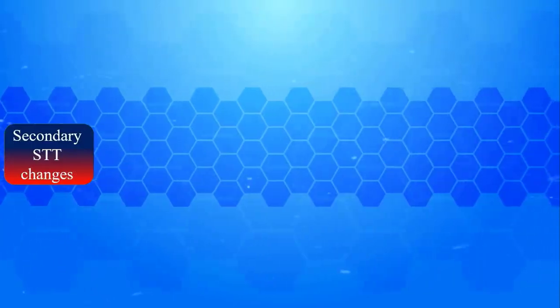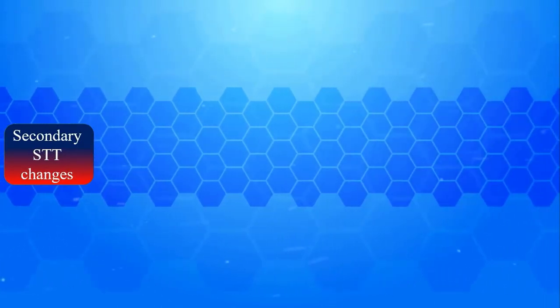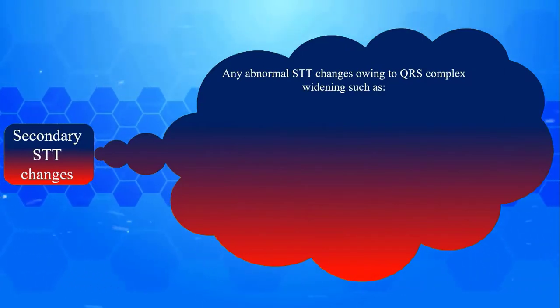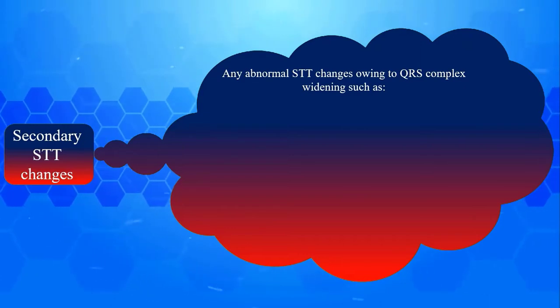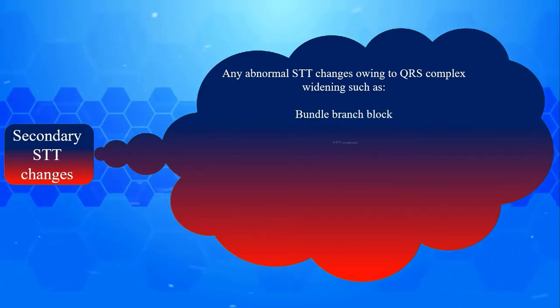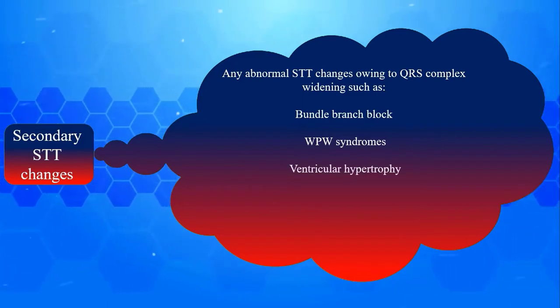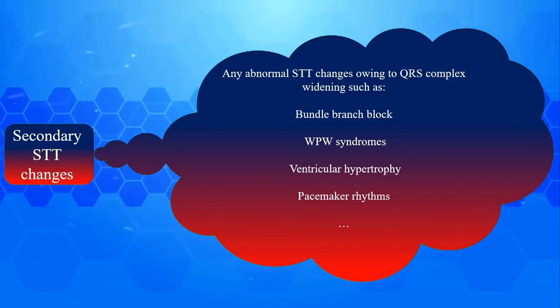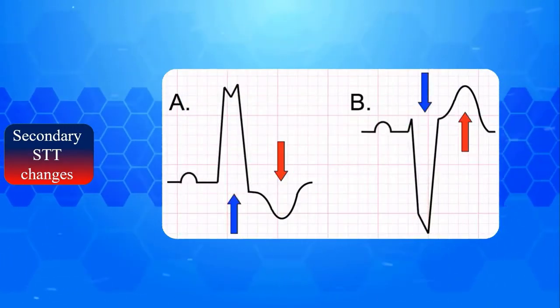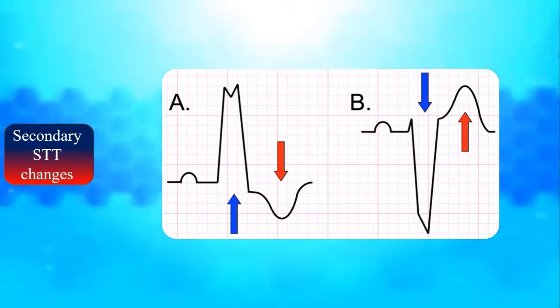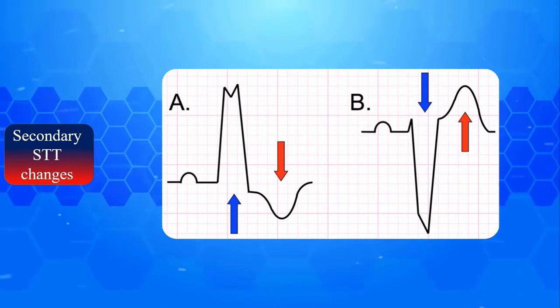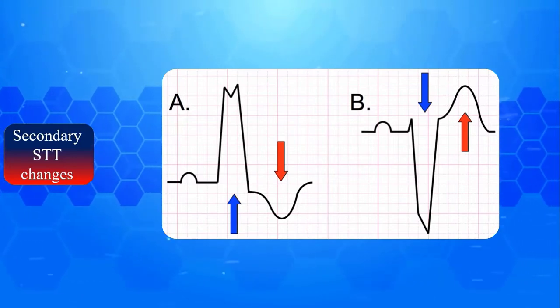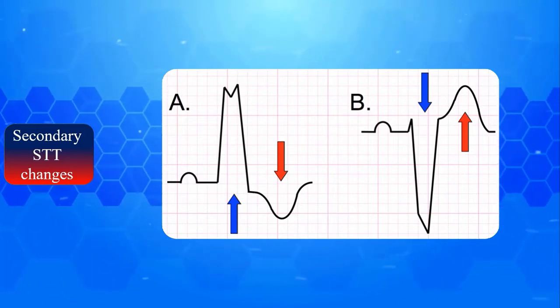In addition to cardinal findings, secondary STT wave changes are frequently observed in LBBB. Secondary STT wave changes is an umbrella term referring to any abnormal STT wave changes due to QRS complex widening. It is associated with bundle branch block, WPW syndrome, ventricular hypertrophy, pacemaker rhythms, and so on. In general, secondary STT changes are discordant — meaning ST segment and T wave changes are in the opposite direction to QRS complex polarity. Therefore, when a deep S wave is present, ST elevation with upright T wave is recorded; conversely, when a prominent R wave is present, ST depression with inverted T wave is seen.